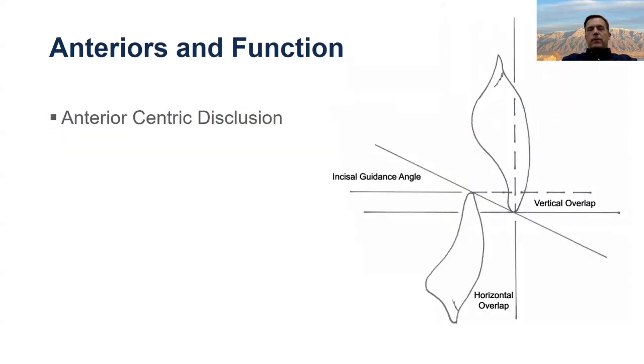So once we've gotten the teeth, especially for a double arch case where we want them physiologically, we want to look at what's going to happen when our patient articulates. In general, with full dentures, we want to provide a little bit of freeway space between the upper and lower incisors, and we'll usually have the overjet and overbite the same. So 1 millimeter of both is very common. 2 millimeters will work with some cases, but in general, we'll want to go with a 1 millimeter overbite and overjet. So the teeth aren't touching in centric, but as soon as the patient articulates, they come together.